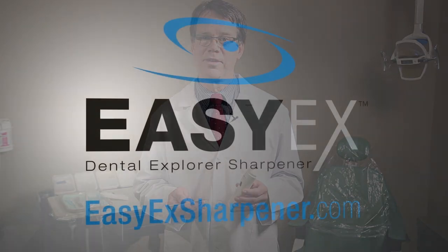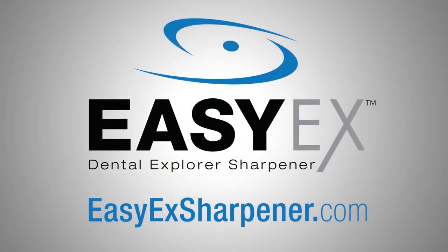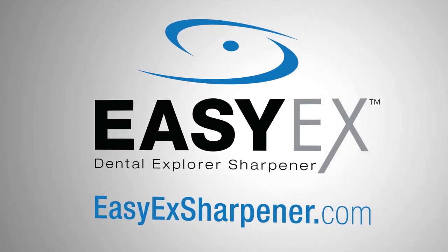Your explorer tip is now like new and ready to use. For more information, please visit www.easyexsharpener.com.